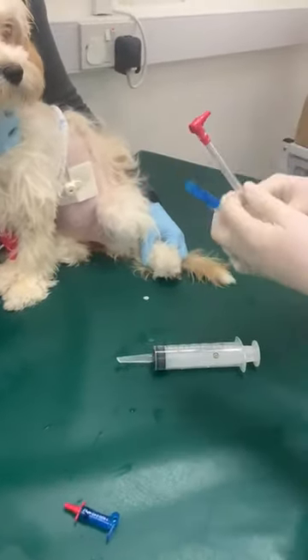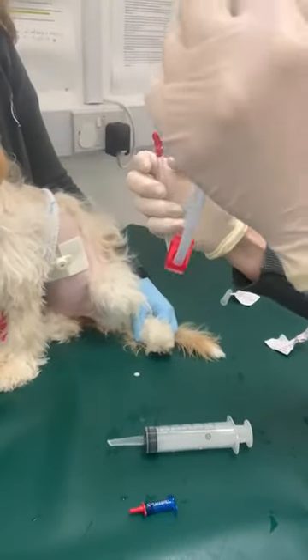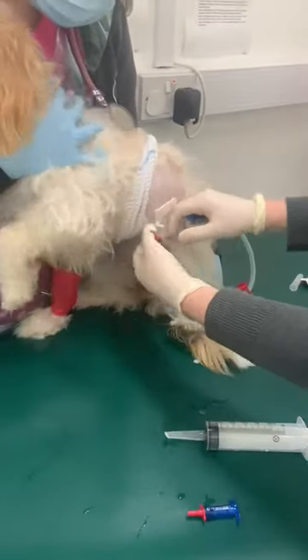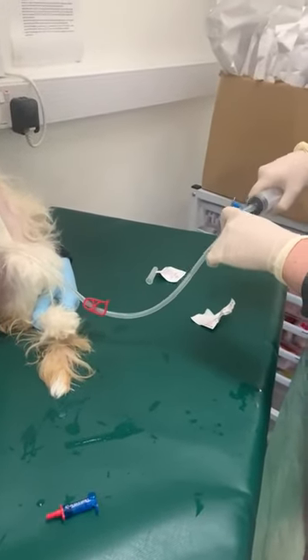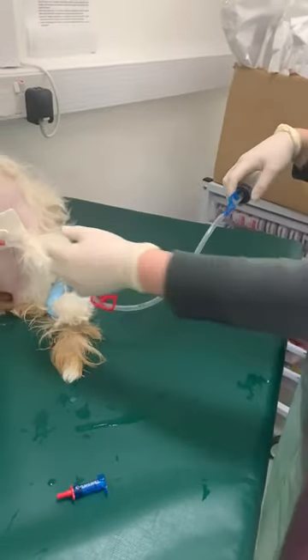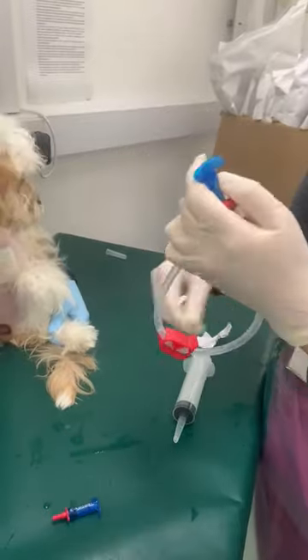If you're using the second attachment, it works the same way — it still has the same part that goes into the tube, but it has a shut-off valve here as well. Attach it via the tube in the same fashion, push it in, then attach your syringe to the end. If you're finding resistance, it might be that the valve is still shut, so open the valve and slowly give your liquid. It pulls off exactly the same way. If you're using this one, ideally fill it with water first so you don't give the patient air.